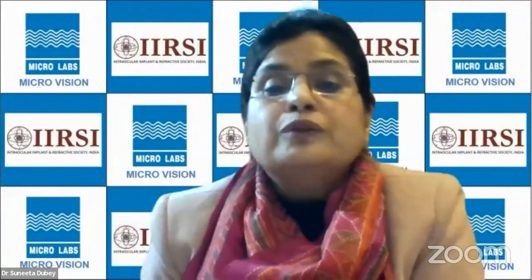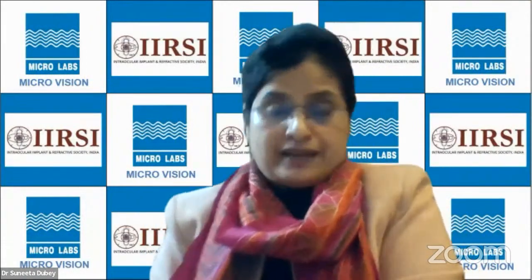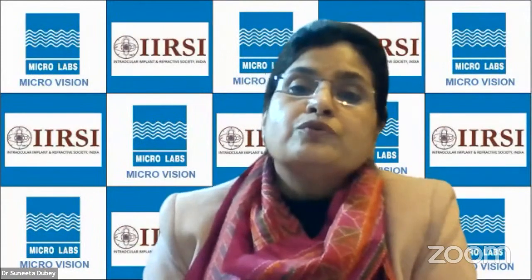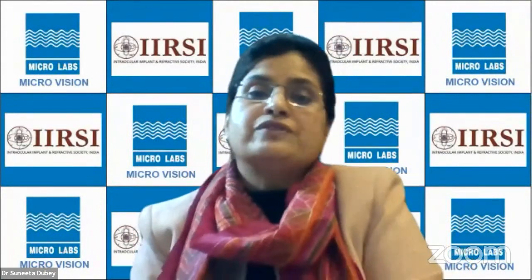Dr. Murli, the question to you about the block, as we are talking about that, we know that a large amount of peribulbar block can be hazardous to the health of the optic nerve. So what kind of block do you use, or do you not use any block? Just tell us about the type of anesthesia you use for these patients.